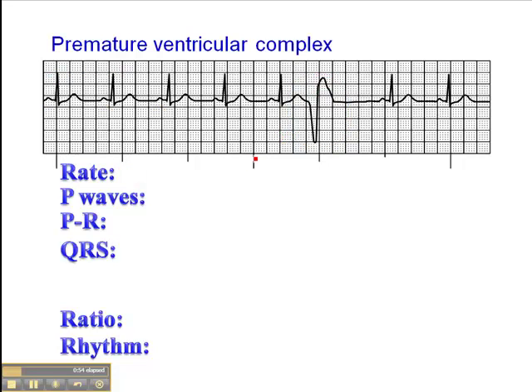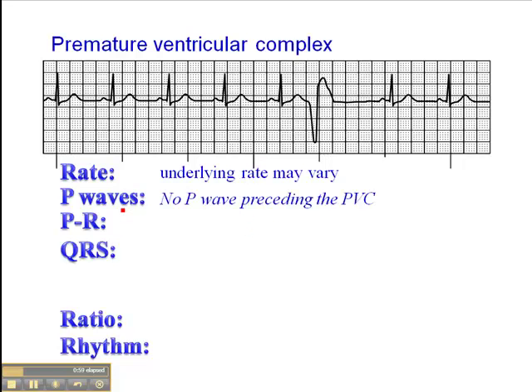The heart rate and the underlying rhythm may vary — it may be normal, fast, or slow. Where there's a premature ventricular complex, there's no P wave preceding the PVC. You'll notice that there's no P wave here; this is actually a T wave here, so we don't see any P wave. The PR interval where the PVC is concerned is not applicable.